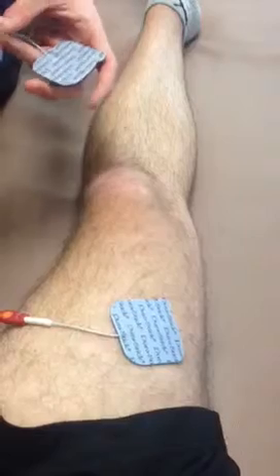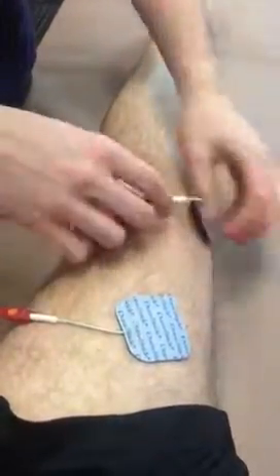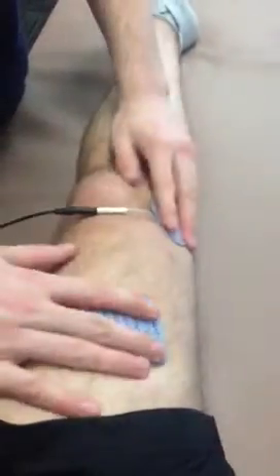And also when doing this, you want to make sure that the affected area, the treatment area, is free of any oil or anything like that that might put the adhesiveness into a compromised state.